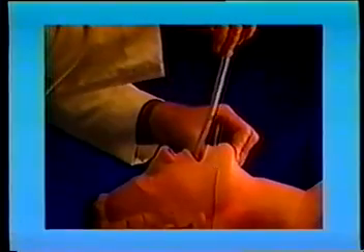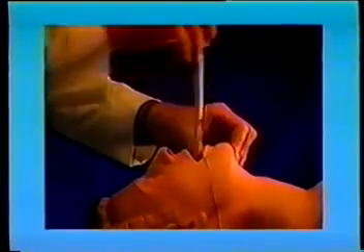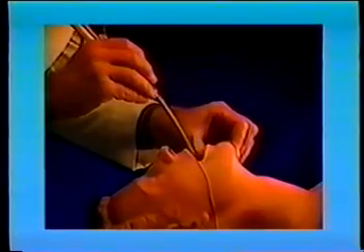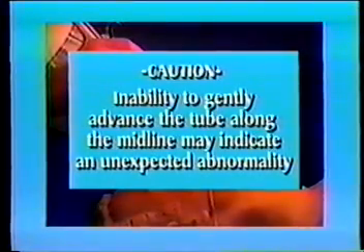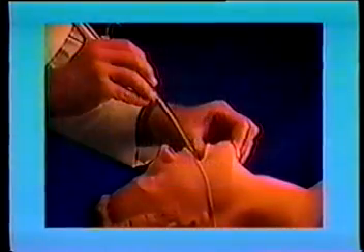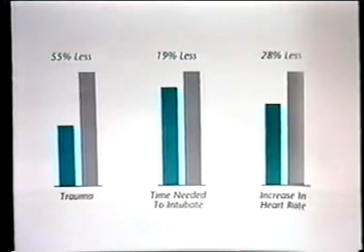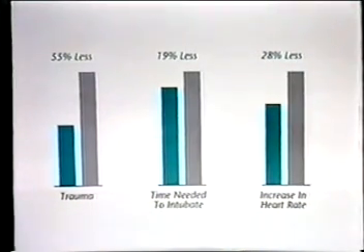When properly performed, light-guided intubation requires almost no force. If during the procedure the upper portion of the wand is bending, too much force is being applied. Rather than pushing harder, pull back slightly, adjust the position of the tip, lift the tongue and jaw, and gently advance the tube again. Inability to gently advance the tube along the midline may indicate the presence of an unexpected abnormality, in which case alternative techniques may be more appropriate. A substantial amount of research has been published on both the technique of light-guided intubation and the use of the TrachLite itself. Recent studies comparing it with laryngoscopic intubation have found light-guided intubation to cause less trauma, require less time, minimize increases in the patient's hemodynamic status, and provide a highly accurate method for precisely positioning in-place tubes. To receive copies of any of these studies, contact your local Lairdorf representative.